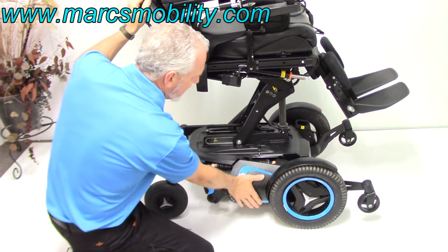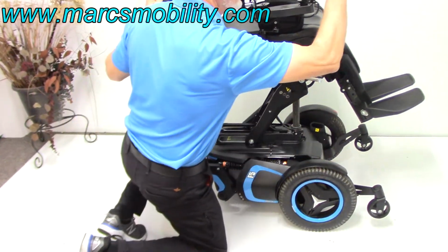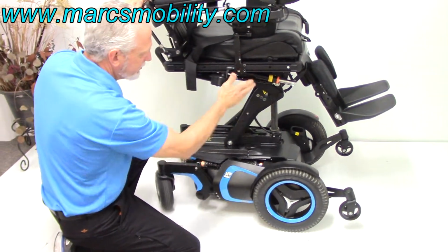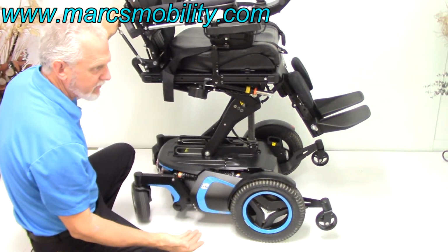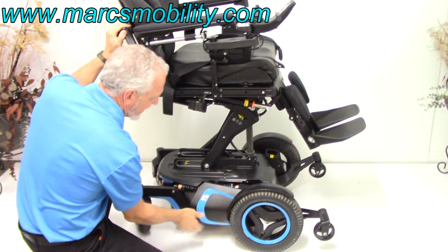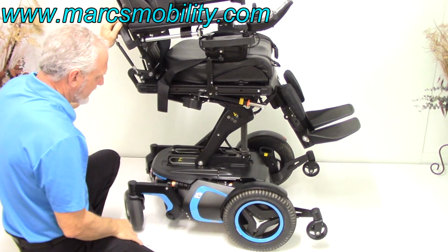You've got a motor here for each wheel, and you can see the lever. So if I wanted to push this chair right now, I can't do anything. I can't push it. You would turn the power off. You would push the lever down, and now you're in neutral. You've got to do both sides, both motors. Raise your levers right here. Remember, this chair weighs 400 pounds, and if you've got a 200 pound person, that's 600 pounds of pushing. It's not an easy one to push, but this is where you would do it. Now you're back in gear. Turn the power back on, and now you can drive the chair again.